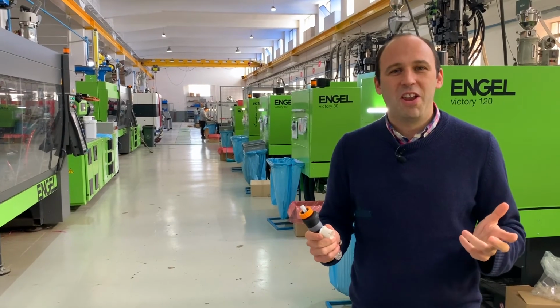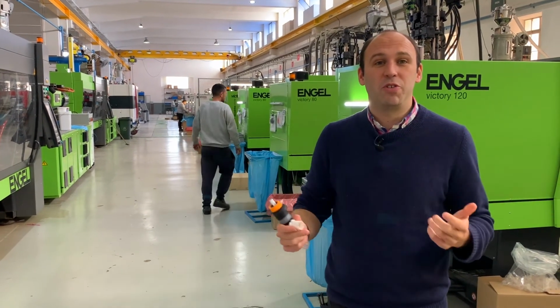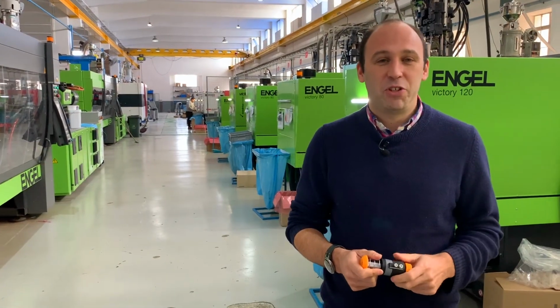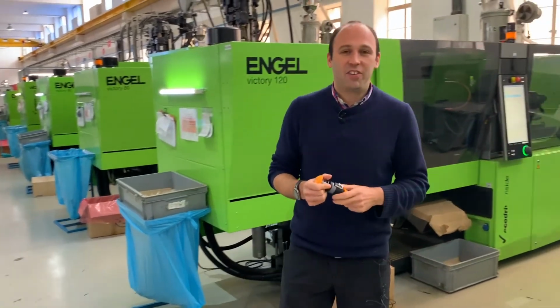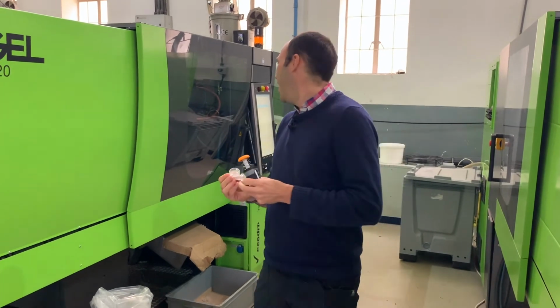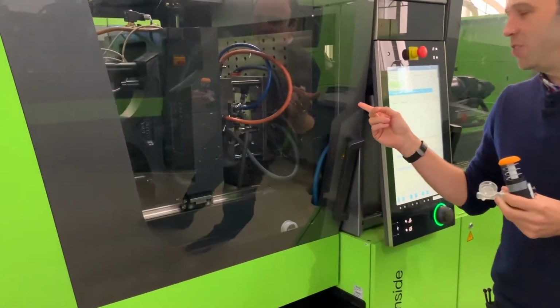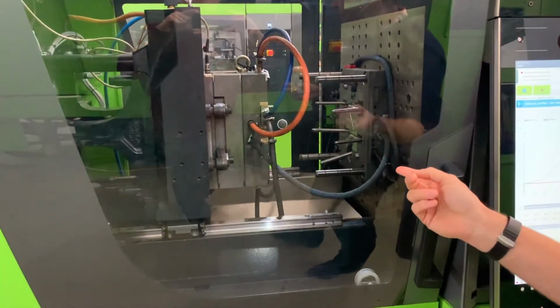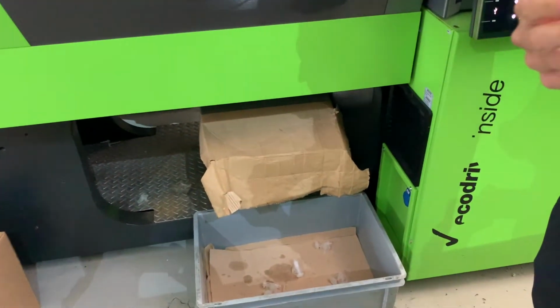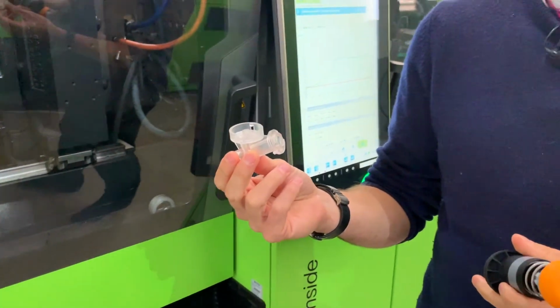So here we are at the Numnuts injection mould factory, entirely renewably powered using the sun. The machine behind us has just been commissioned up today, and it's sampling this part we call fluid junction, and the mould tool's currently just opening. So you can see it injects two parts at a time, spit out here.